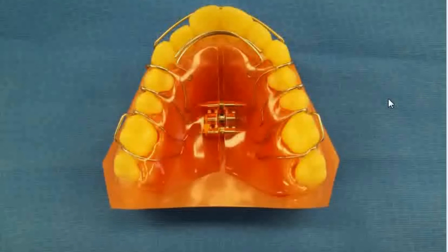When you seat this appliance, it should fit tightly. You may need to adjust the clasps slightly to gain as much retention as possible. If the appliance is loose, it may be difficult for the patient to wear, so try to make it fit as tight as possible. If you'd like more information about how to adjust the clasps or any part of this appliance, we have a great appliance adjustment DVD that you may want to order.